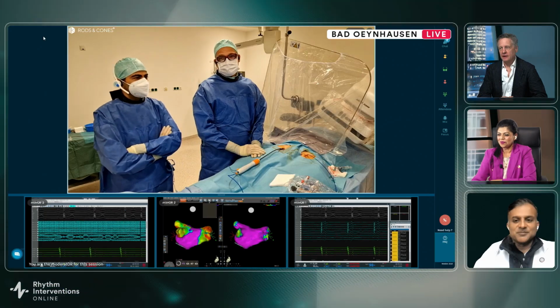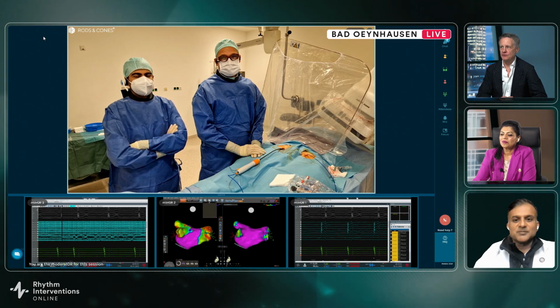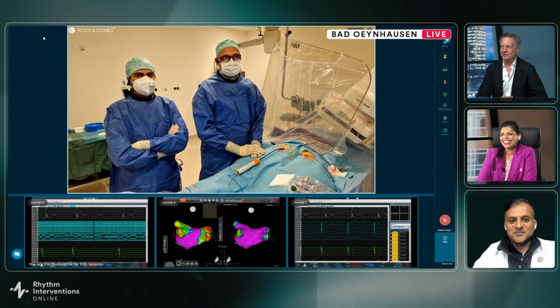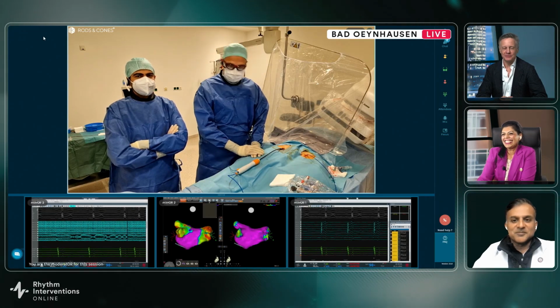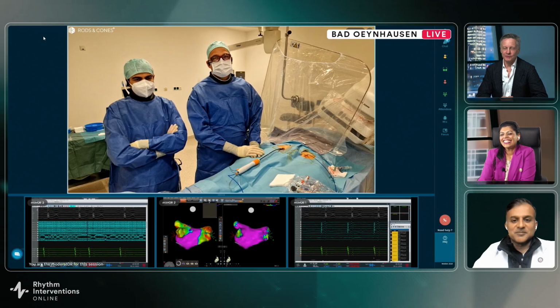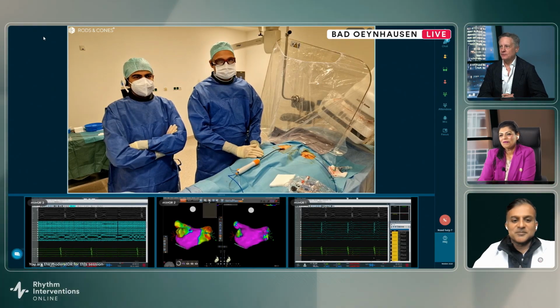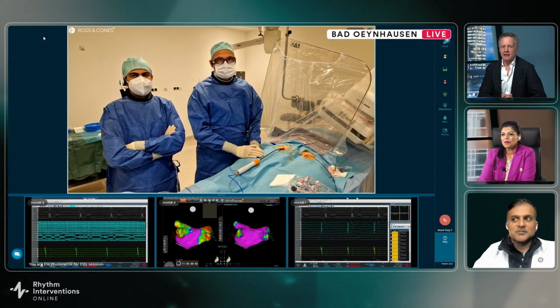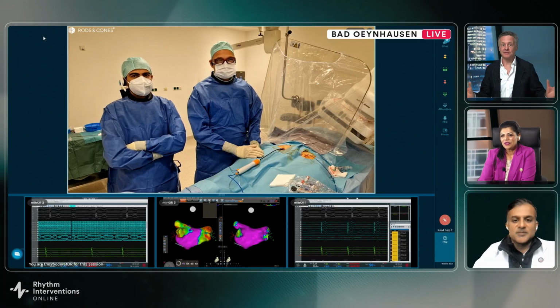Well, I have to say that I'm pretty annoyed with you and your team because you've made me work very hard. You're so quick at the ablation. I've had to think of lots of questions and discussion points to fill in the time because the procedure was so quick. So you're all very naughty, but thank you so much for staying late and sharing this case with us. And of course, thanks to the patient as well, because I'm sure everyone's learned an enormous amount from their case. And so that brings us to the end of the session.